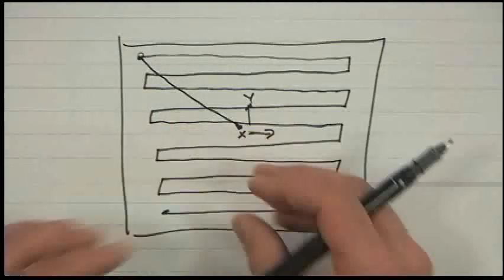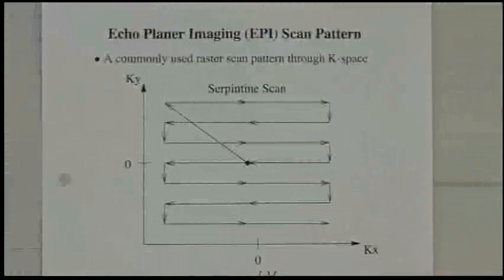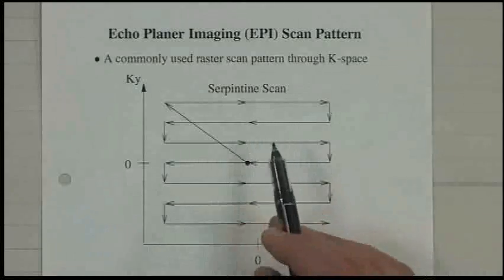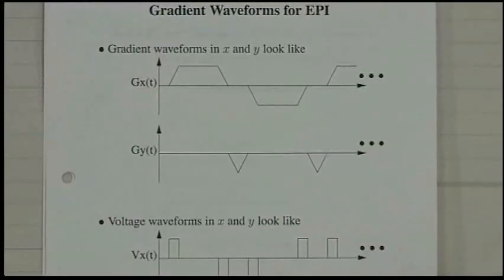So basically, you have to drive around the space to collect the data, and that's why MRI tends to be kind of slow, although there are parallel acquisition modes. Next time I'll go over this. These are basically the accelerator pedal settings, because it's the second integral of the voltage pulse that determines your position in K-space. And you can study these.